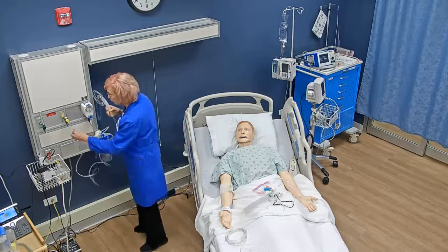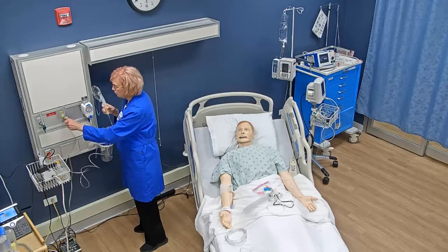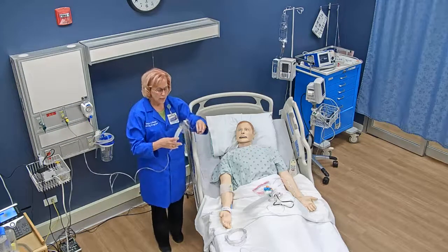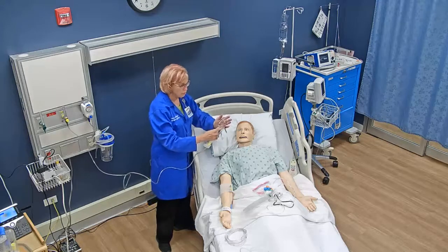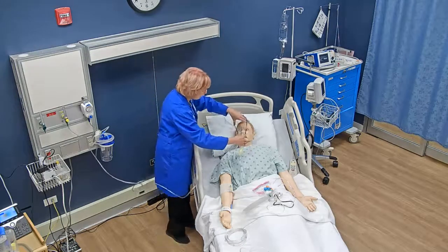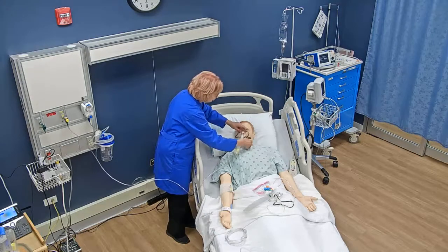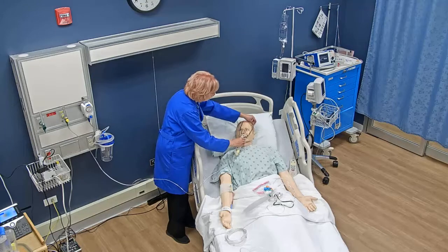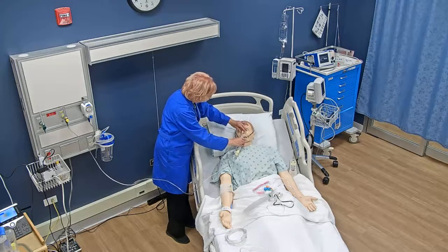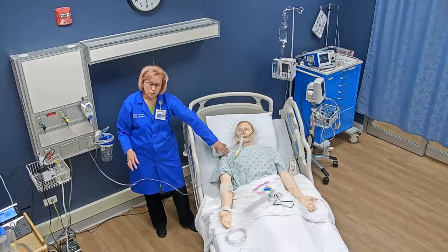Each adapter specifies how to set it up. I set my flow meter at 4, verify the oxygen is flowing, and put the mask on the patient — making sure the nose clip is at the nose, the mask covers the mouth and is under the chin, and the elastic goes around the back of the head. It is now set up to deliver 28% oxygen.